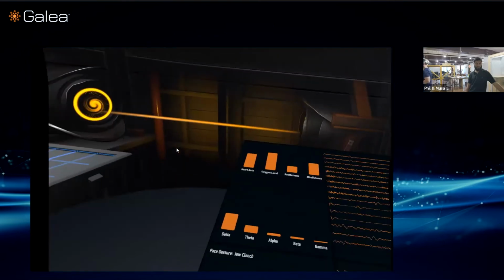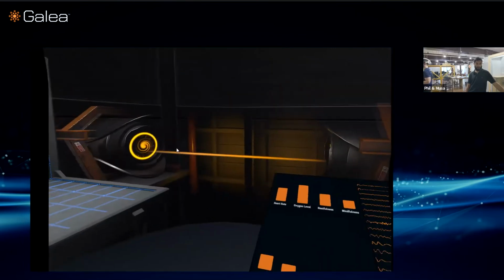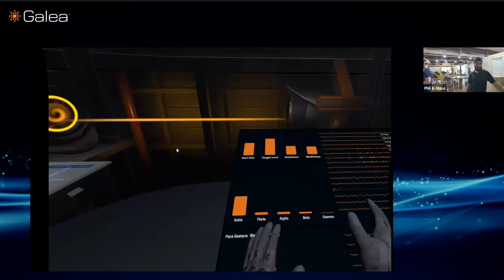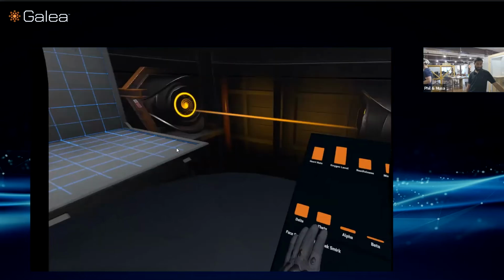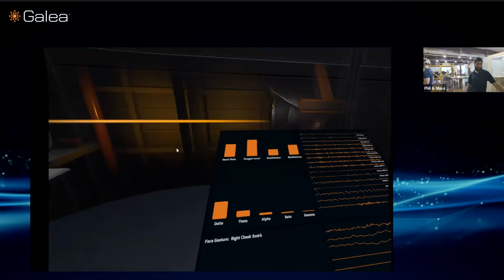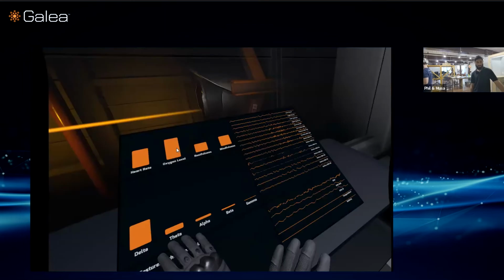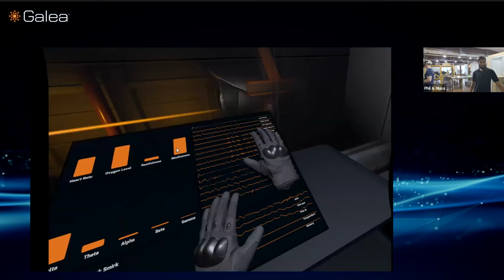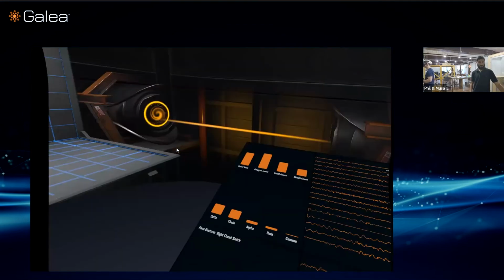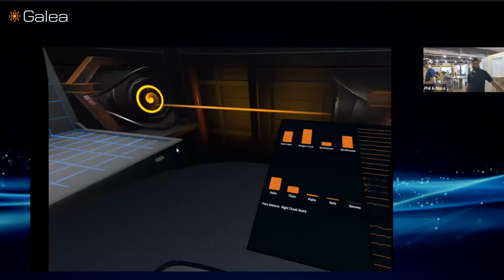Mindfulness works in a similar way. Mindfulness is more related to concentration, the type of concentration that you might think of when you're playing chess, for example, and you're really focused and you want to have good moves in chess. That's what's related to this mindfulness metric. And so neuroscientists obviously will come up with different metrics that they'll measure using these sensors, and using the other sensors in Galea, you can start to support these different mental states. And that's one of the cool things about this headset. We're not just relying on EEG, but also a whole plethora of sensor modalities.